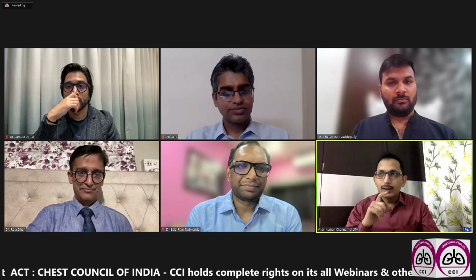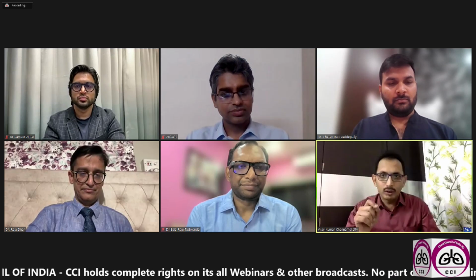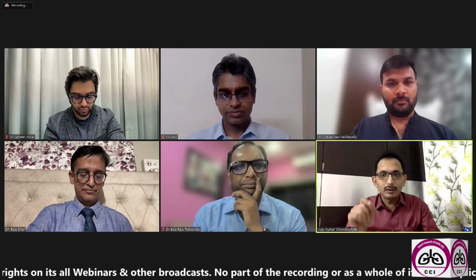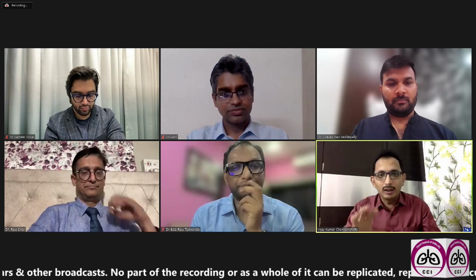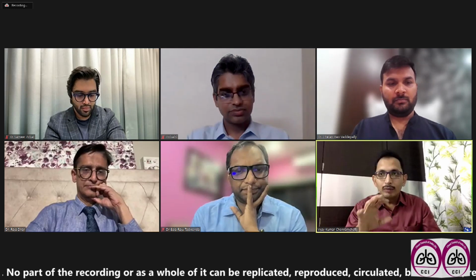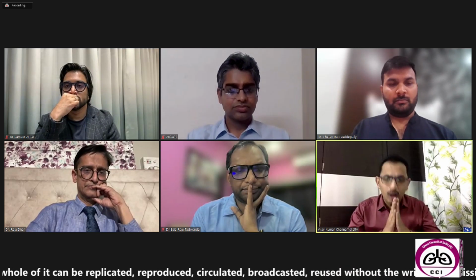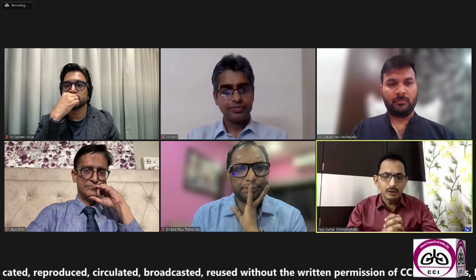The second important thing is, we made it mandatory for all procedures wherever we use cryo, particularly cryo lung biopsies, that within 1 hour in the post-procedure recovery period, they get a chest X-ray, and then they are closely monitored for any desaturation or signs of distress. So that's one thing we made mandatory. And out of probably 10 cases of pneumothoraces, none required intervention.